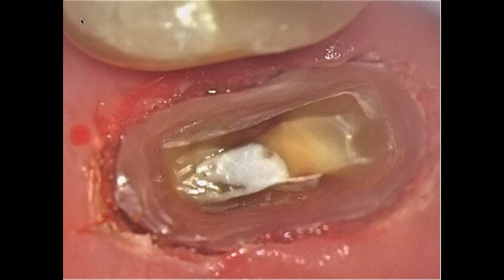Okay. Another question: if you use the microscope every day and all day long, is it possible or is it hard for you? No, it's not hard. I think it's easier. Of course, you don't use it all the time. I would say even if you use it during every treatment, you will work with the microscope about 50%. And of course, there's some technical work when you don't use it, but inside the oral cavity, about 50%.